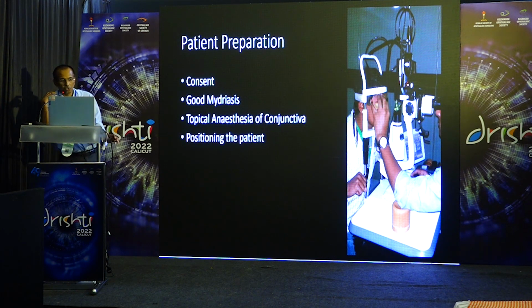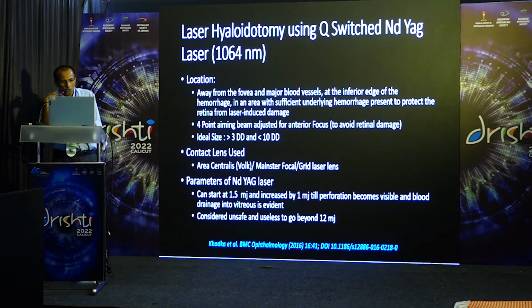You have to have the consent. A good mydriasis is important. Anesthetizing the conjunctiva, positioning the patient. The patient should be comfortable. The surgeon's comfort, nobody really talks about that, but that is also very important. So use the Q-switched Nd:YAG laser, the 1064 nanometer laser.